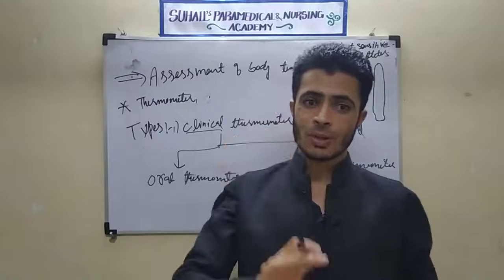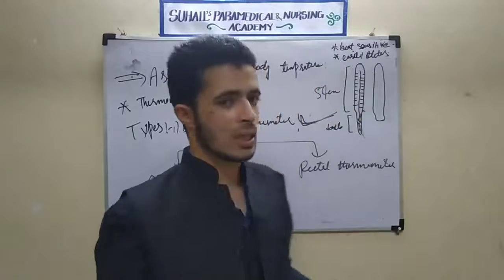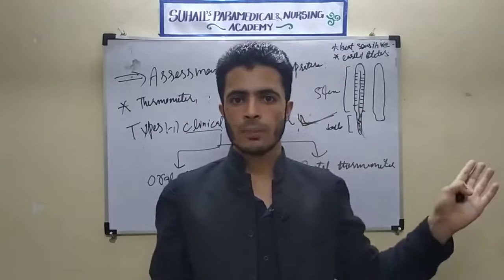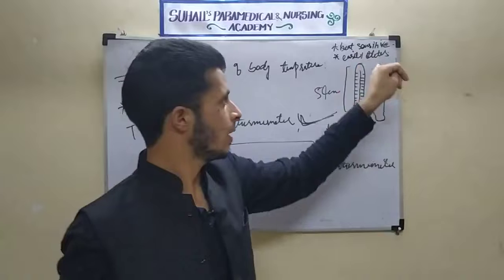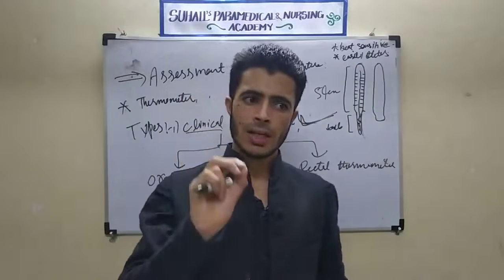So this also makes it suitable for the thermometer. Otherwise, if there is a high change in temperature, the mercury will boil and undergo vaporization. That is not happening here. That is another point why mercury is used. One more point is that it has high surface tension.